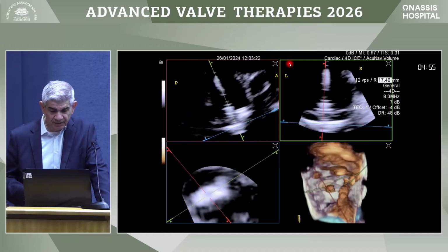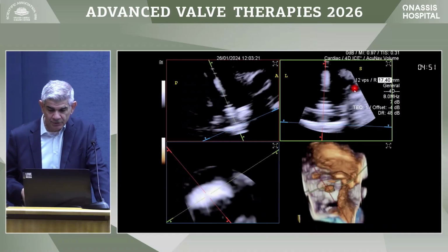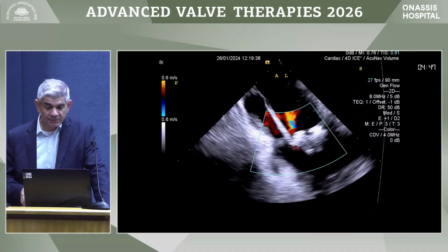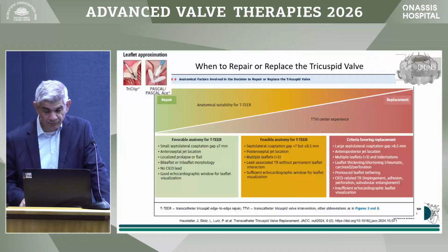And here's the second device next to it. We are positioning septal here, lateral here. There's also pacemaker wire nearby. And this can be very helpful, especially in very difficult imaging cases when TEE is not very helpful.